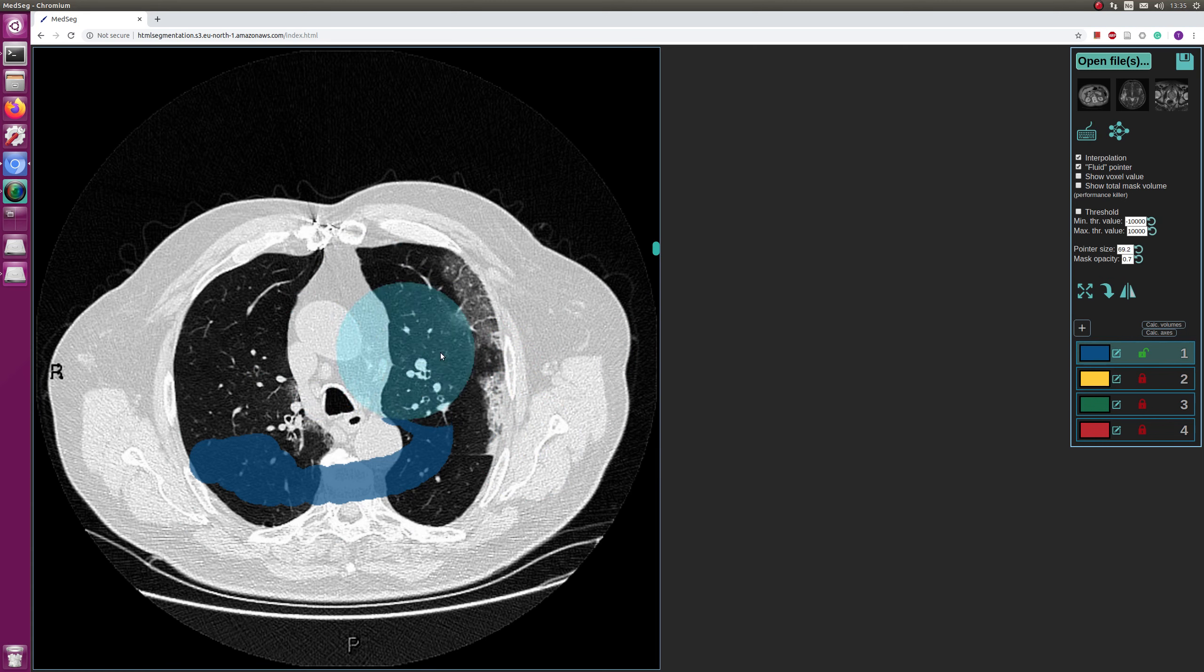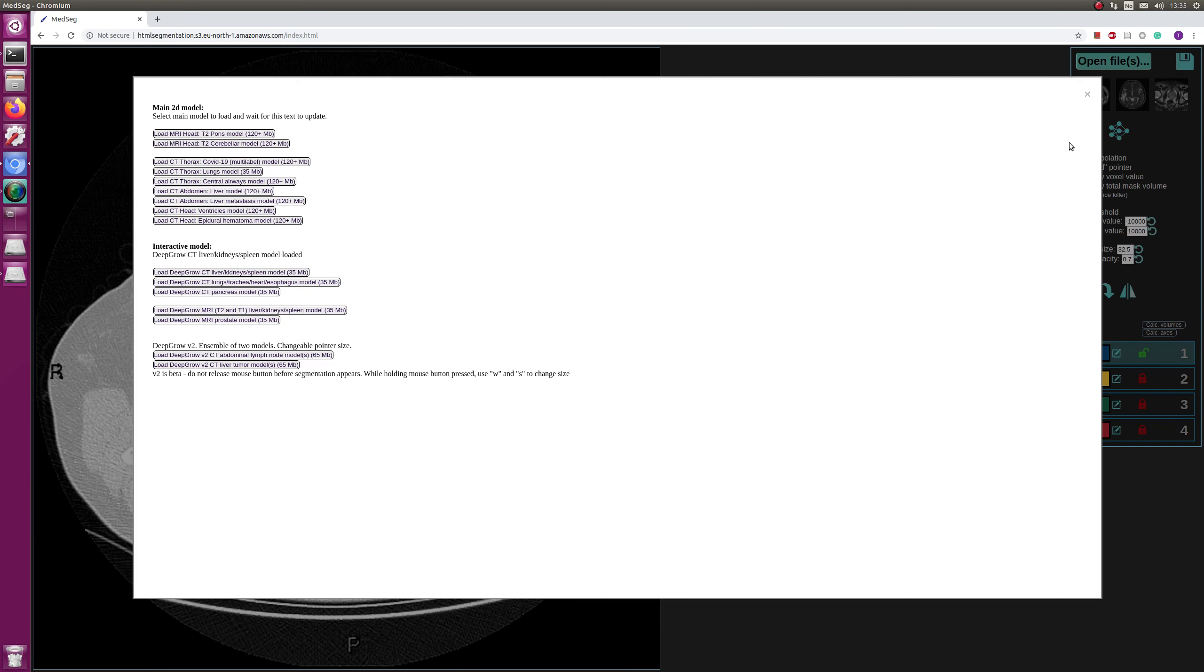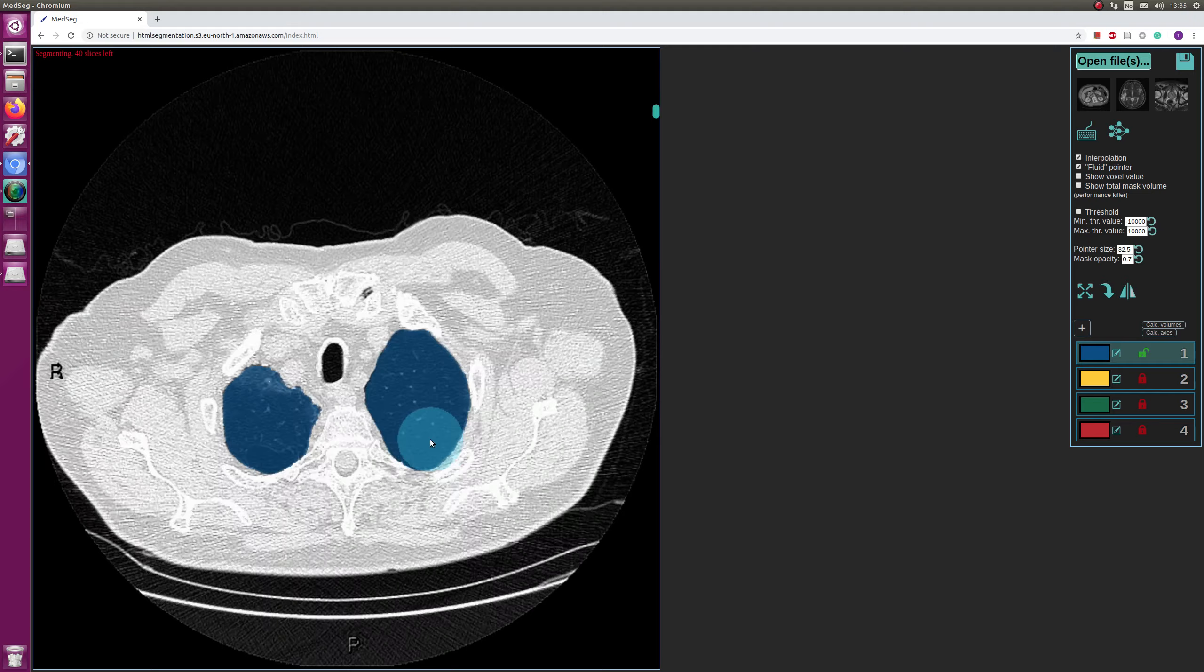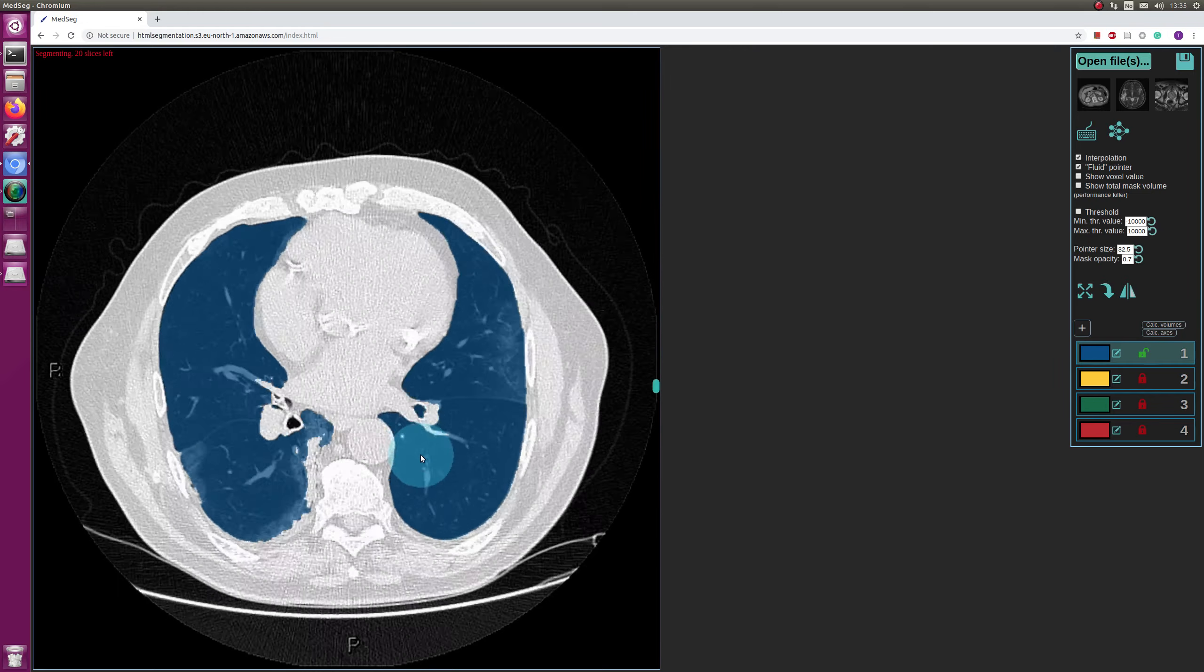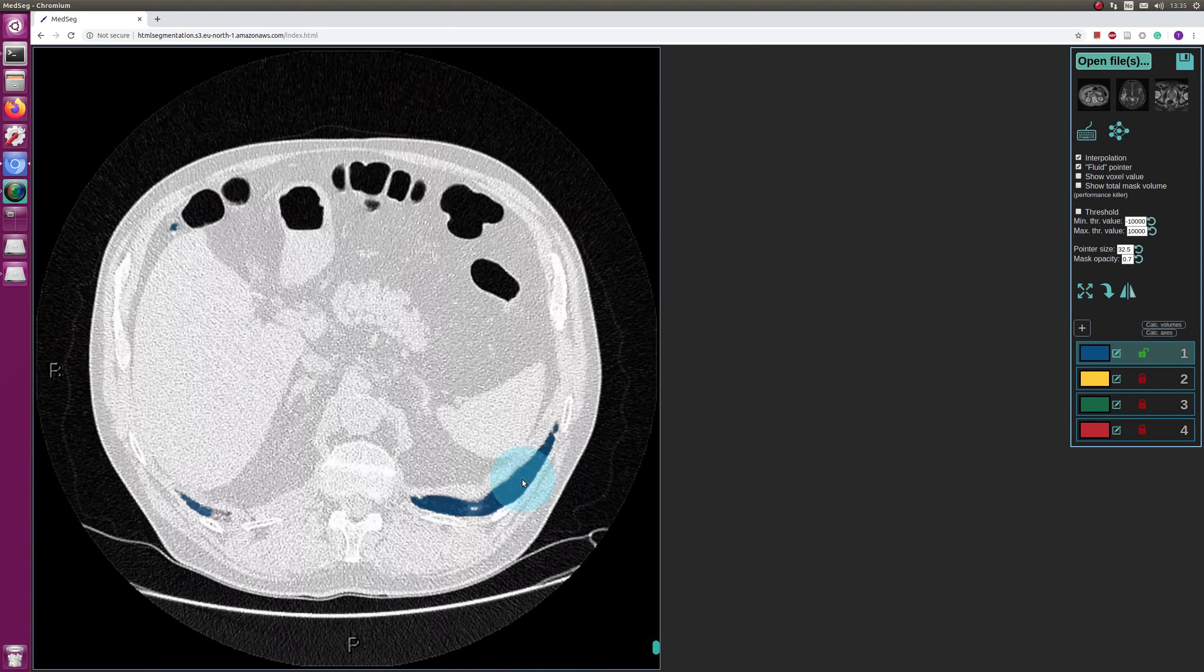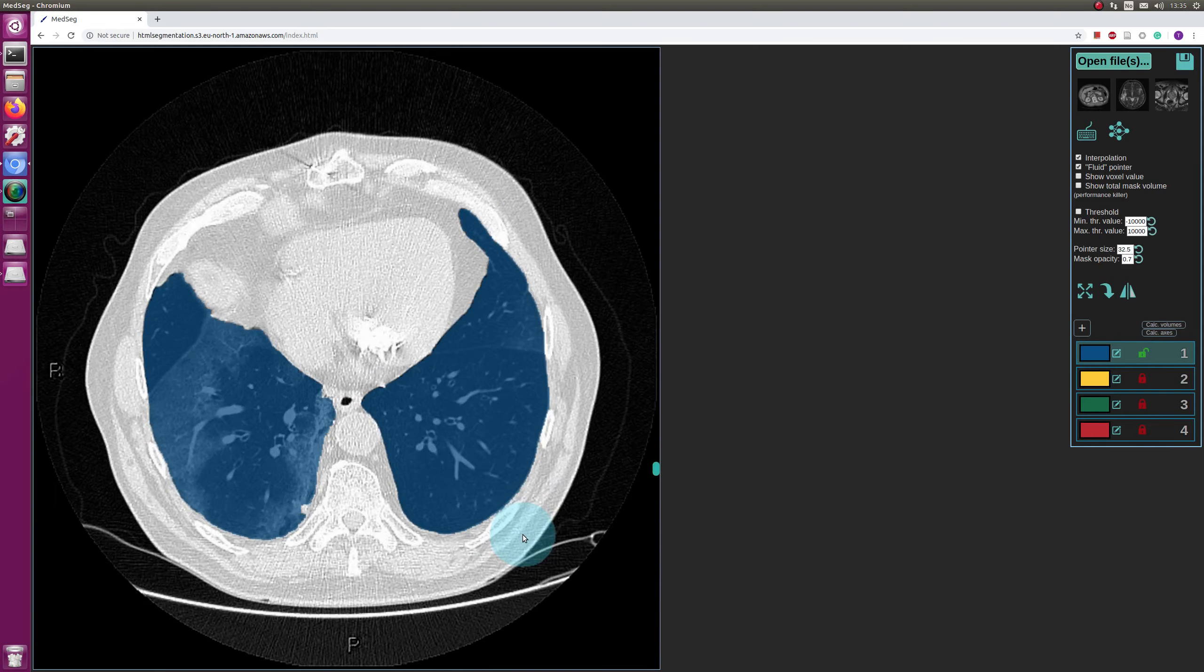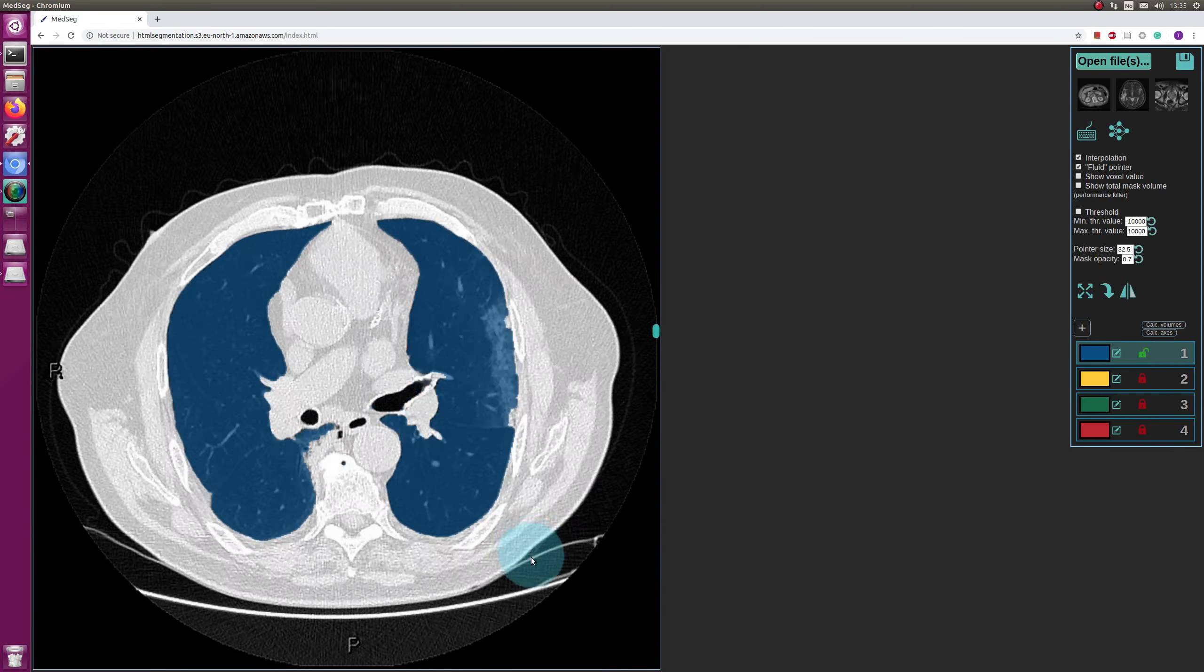So I will just load a model, the lungs model, and now this text has been updated so now it's loaded. And with the press of the space bar I get a segmentation of this one slice, but we want to do this for all the slices, so then I press capital P and now it does segmentation of all the slices. And I already saw there were quite some errors that we need to correct.